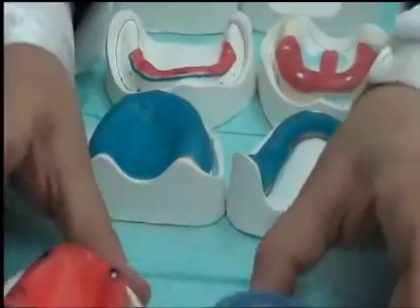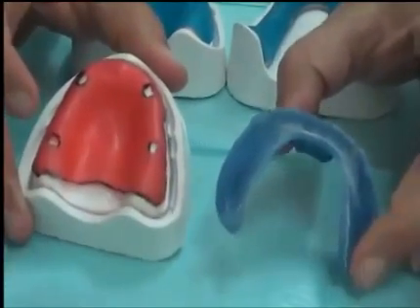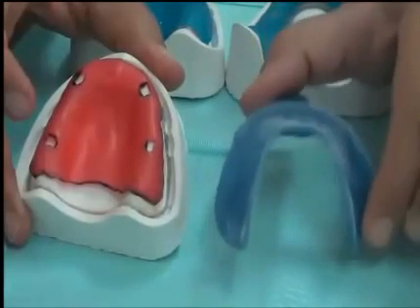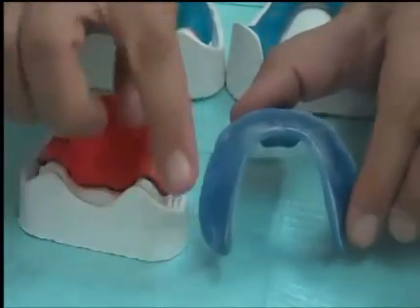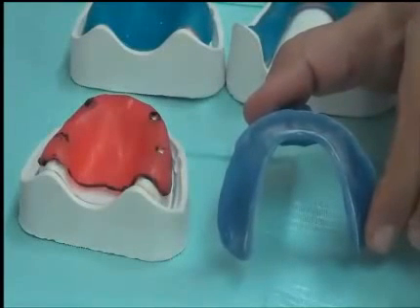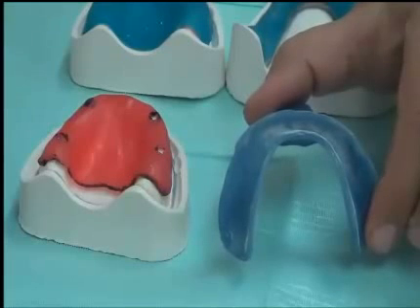But if we have the case of full wax relief or no wax spacer relief with no holes, what will happen is either all of the impression material will be compressed against the soft tissue, and we will have problems later with the compression of the soft tissue in areas, hazardous areas like the nerves, for example.